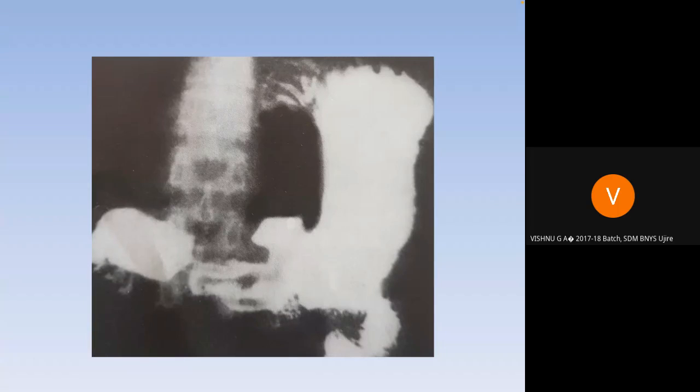Just look. It is looking dirty. First of all, once things start looking dirty, you should suspect. What should we suspect? Here we have one growth here, one stomach here, outpouch here. This is an ulcer, this is a growth. This is a dirty looking growth, mucosa is destroyed, and the shape of the whole stomach is looking bad. This could be because of a growth, an ulcer, a malignancy. This is how it will look.